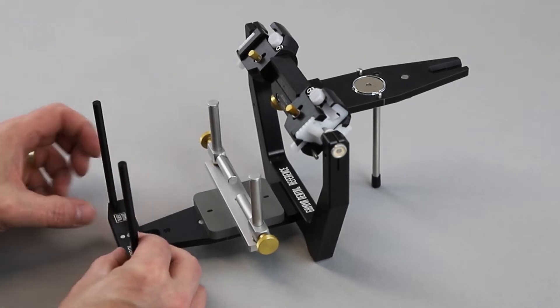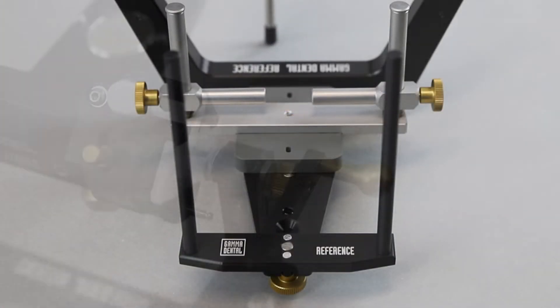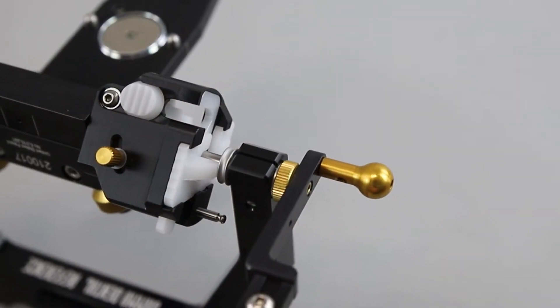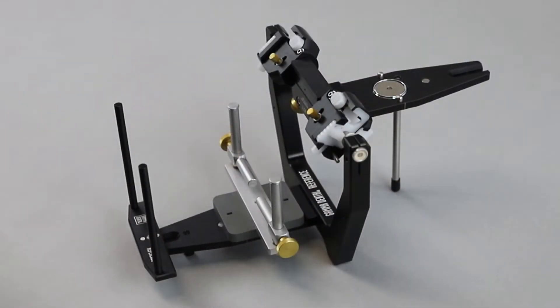The correct position of the face bow support is achieved when the labeling can be read normally. Pull apart the side arms of the reference AB face bow.